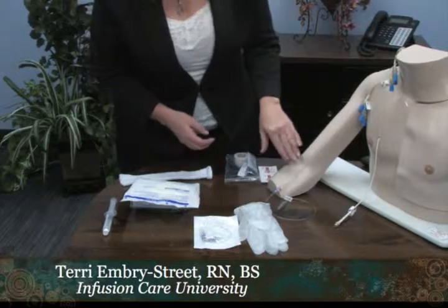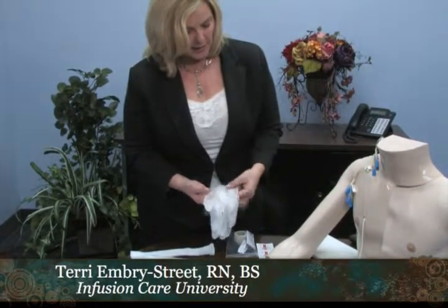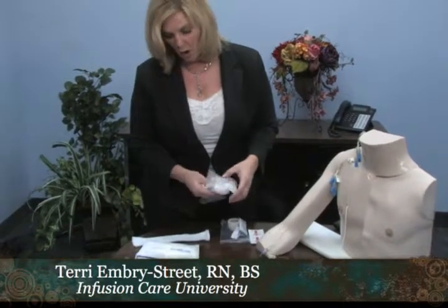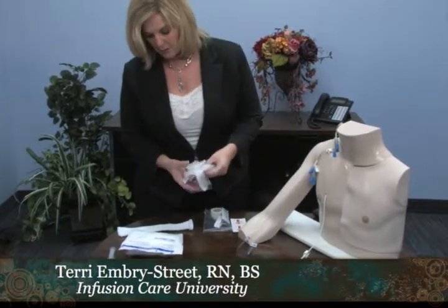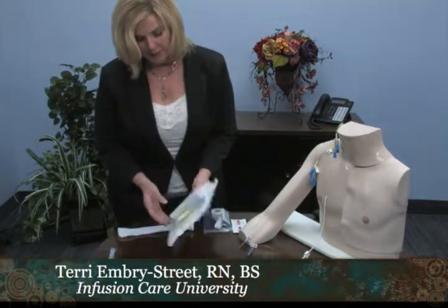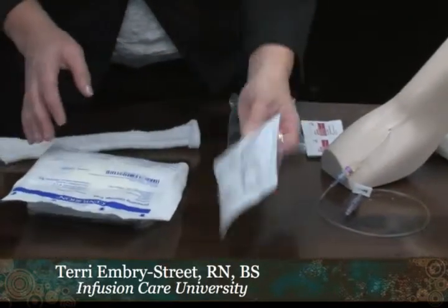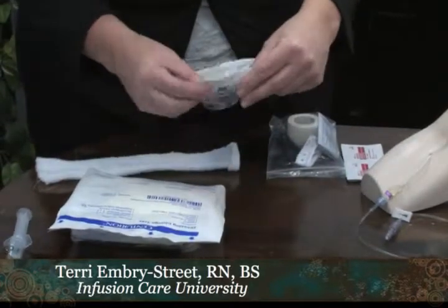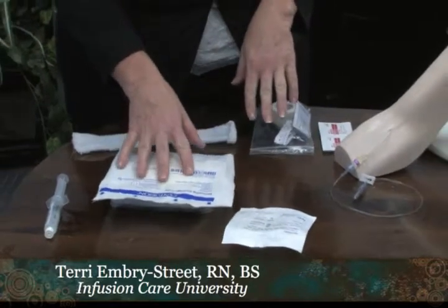If this patient had a dressing on, I would apply — of course wash my hands first — talk to the patient about the skill we're about to perform, and use my clean gloves to remove the old dressing off the PICC line or the site on the chest. When grabbing all my supplies, I inspect them to make sure the expiration date is good and that there aren't any tears, wet spots, or anything on the packaging, to ensure nothing has had any exposure to germs.